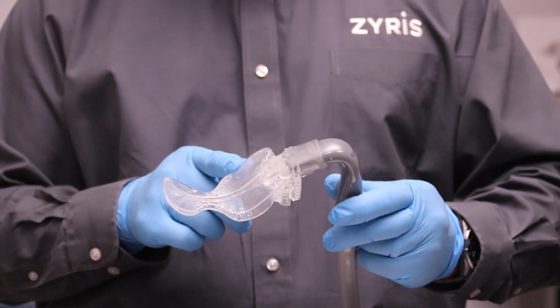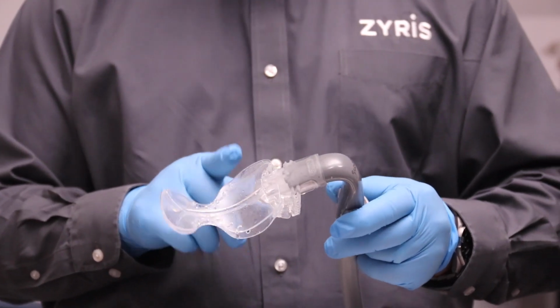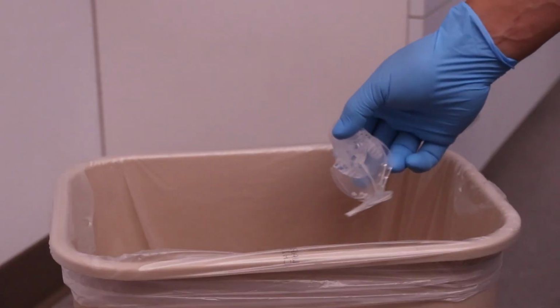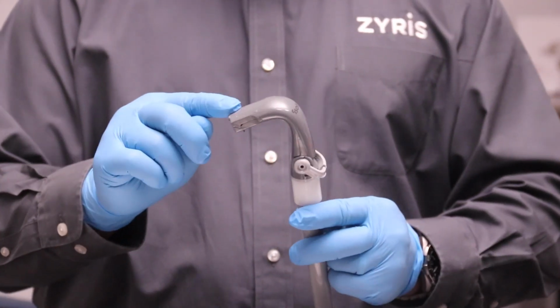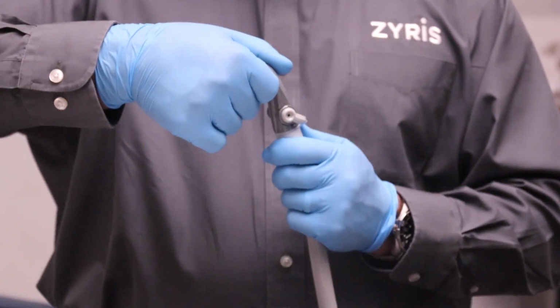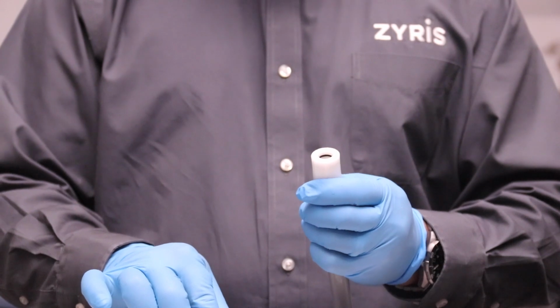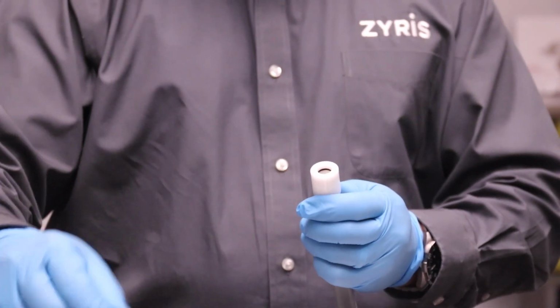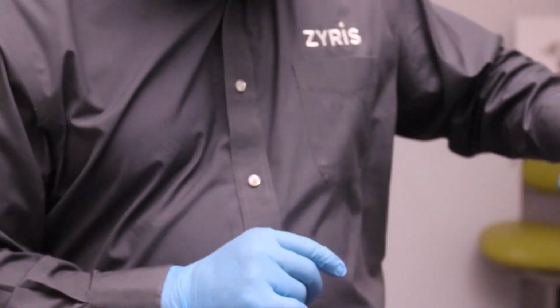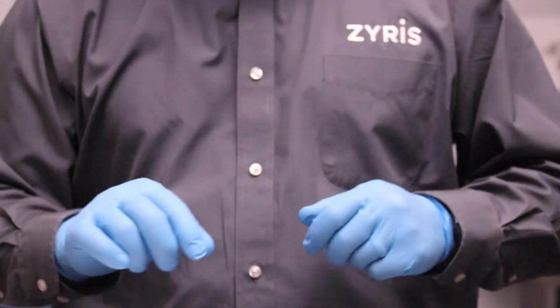Upon completion of your posterior procedure, remove the posterior mouthpiece and discard it. Every Isolite mouthpiece is one-time use only. You'll also need to remove the Isolite core posterior control head to clean it. Pull it off of the HVE. And so you don't have an open line in the operatory, take the line plug that's included in the system and put it on and rack your HVE hose.